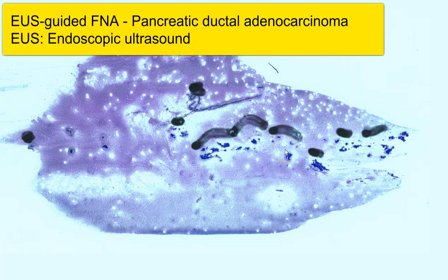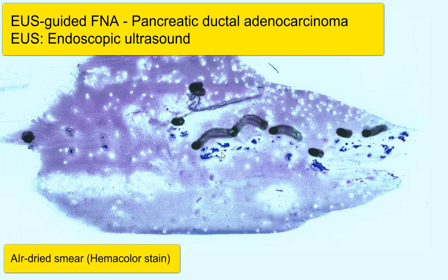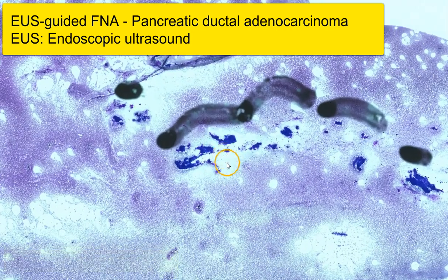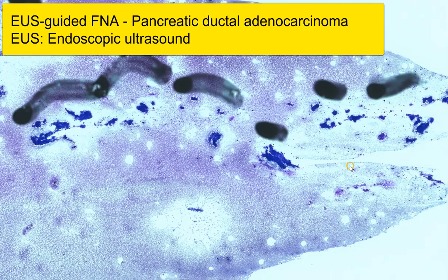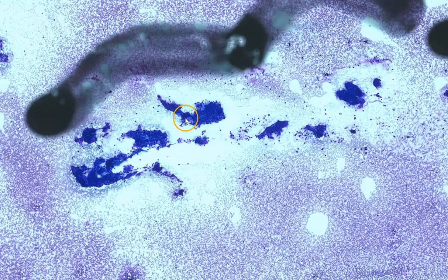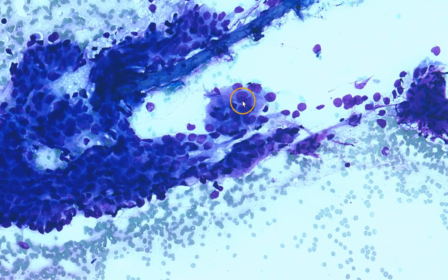This is an EUS FNA of an adenocarcinoma of the pancreas, and we are looking at the hemacolor-stained air-dried smear. You can see that this smear is moderately cellular, and as we zoom into the area of lesional tissue, we can see some cohesive sheets of cells, and the cells appear to be somewhat disorganized. They are not arranged in a very regimented honeycomb arrangement.